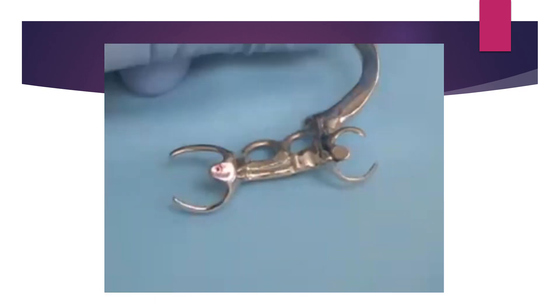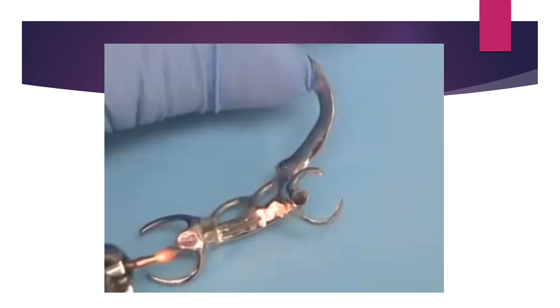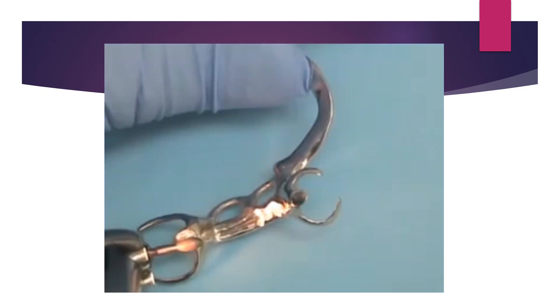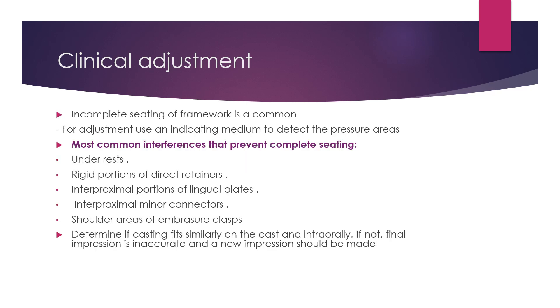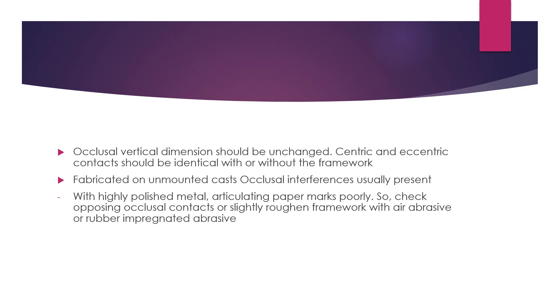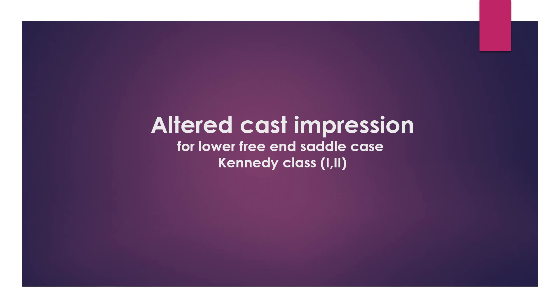If after reduction the thickness becomes less than half a millimeter or there is risk of fatigue fracture, the solution is either to correct the rest seat preparation and remake the framework, or to proceed by accepting the situation. Once confirmed fully seated without occlusal interference, proceed to take an impression of the free-end saddle part to record it.